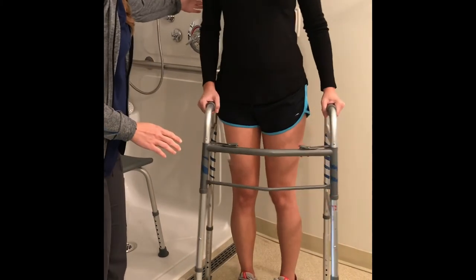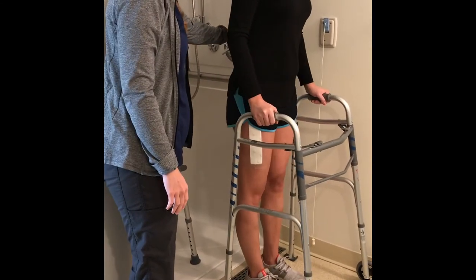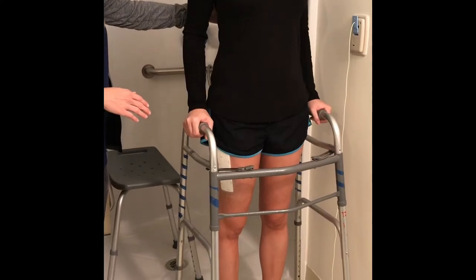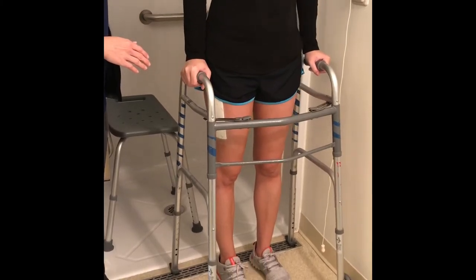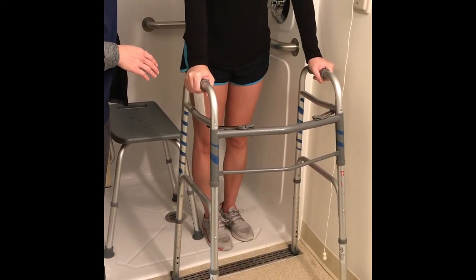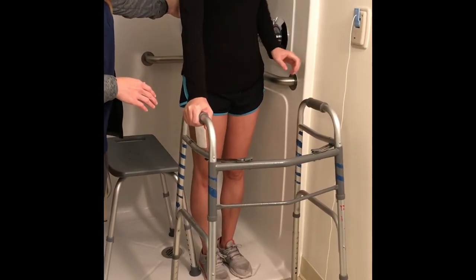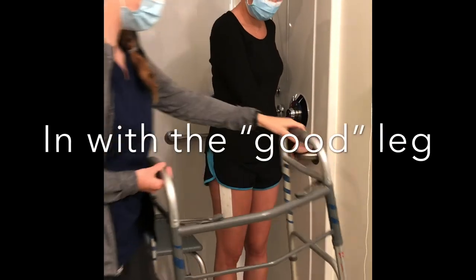Your caregiver should stand to the side with one arm behind you for support. While supporting yourself with the walker, step back into the shower with your non-surgical leg first, then your surgical leg, being sure to clear your feet over the lip of the shower. The order for getting in the shower is the same as when you're climbing upstairs — in with the good leg first.